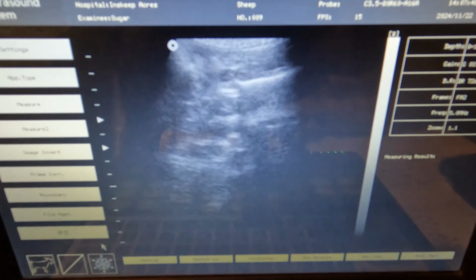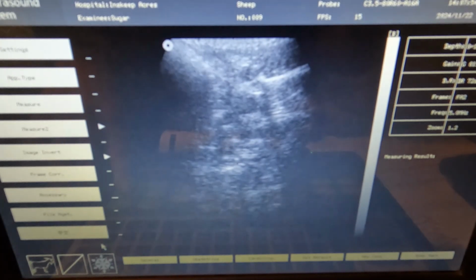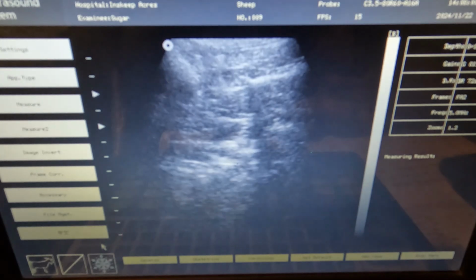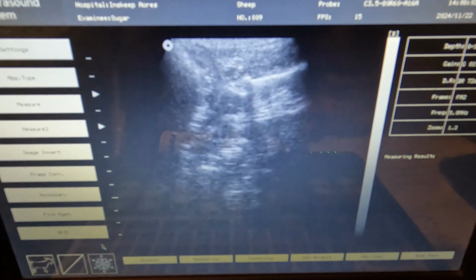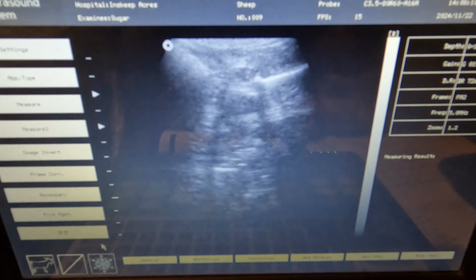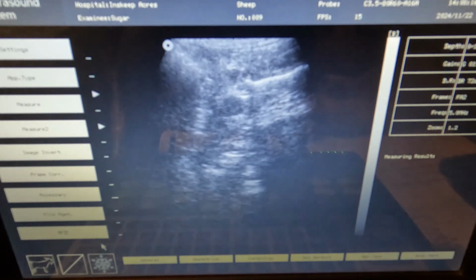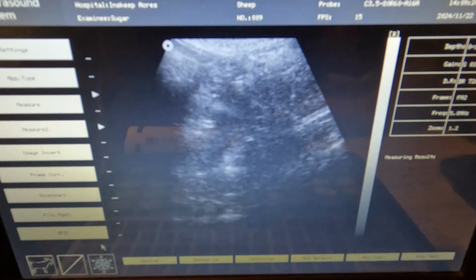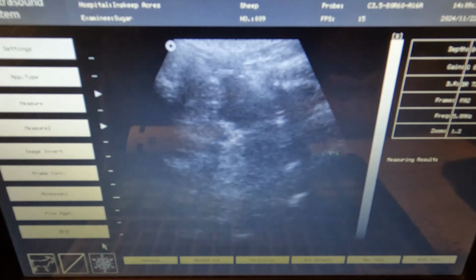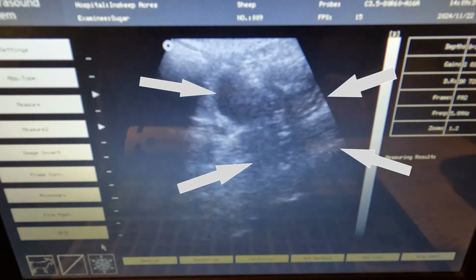So I'm thinking here, if she's at, well, 42, 45 or so, they say is kind of best to count. 45 to 47, I think. Okay, 1 in the top middle. I put some arrows because I can't let go of her. I got my hand on her spine. Her top right.